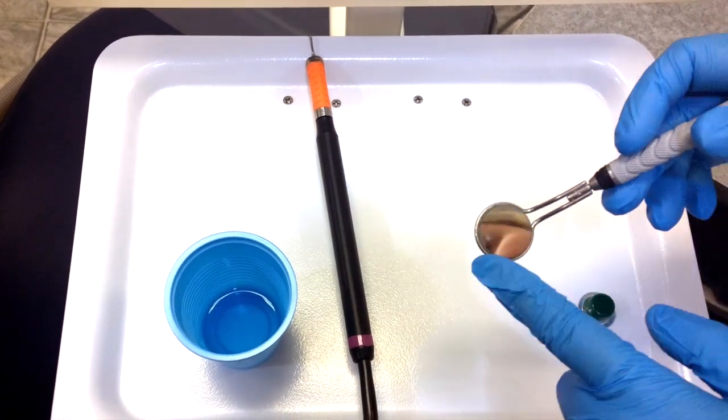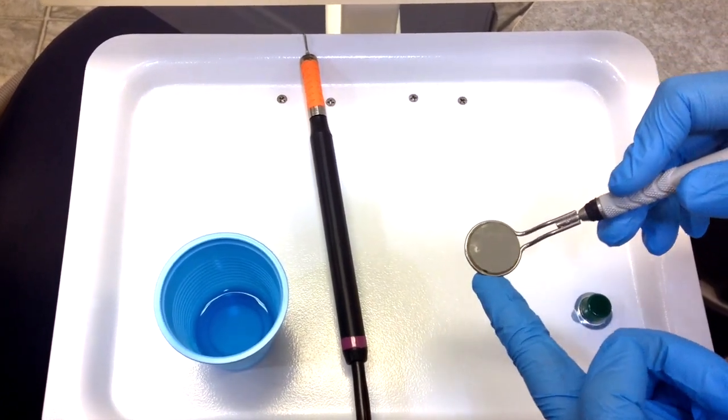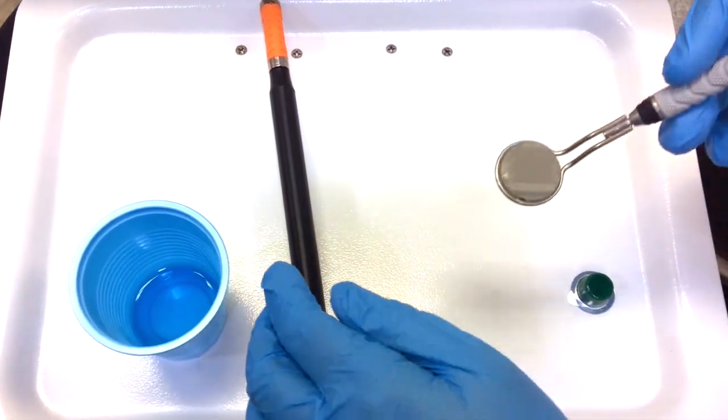Today we're going to show you how to prevent water building up on your mirror as you're ultrasonic-ing. There's a couple different tips you can use.